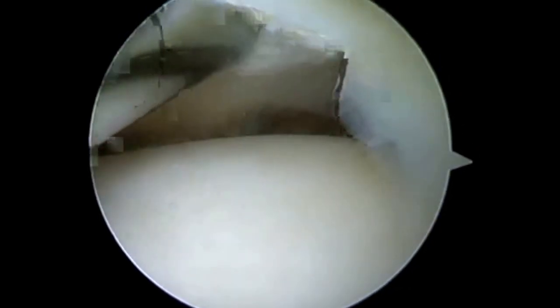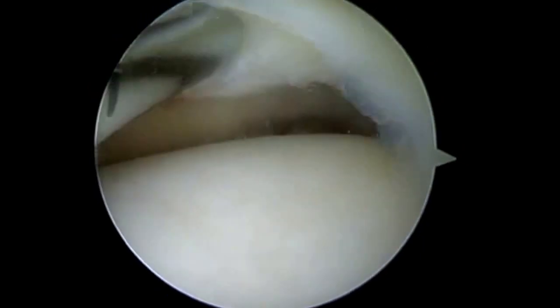Dr. Chris Dordy here again. We're going to go over why I like a circumferential stitch versus a meniscal fixator device.